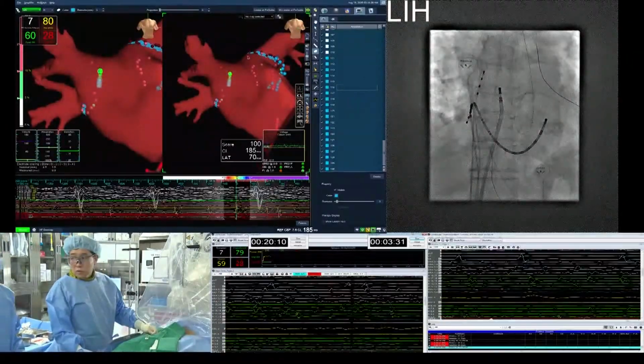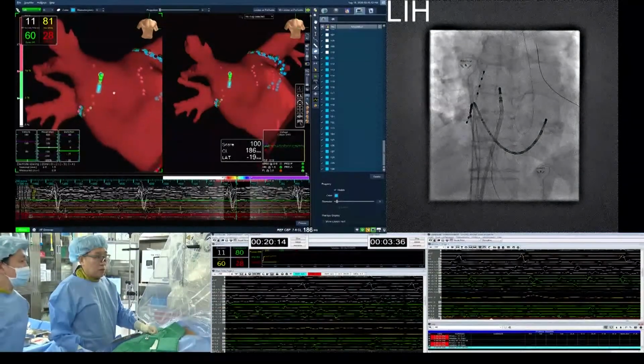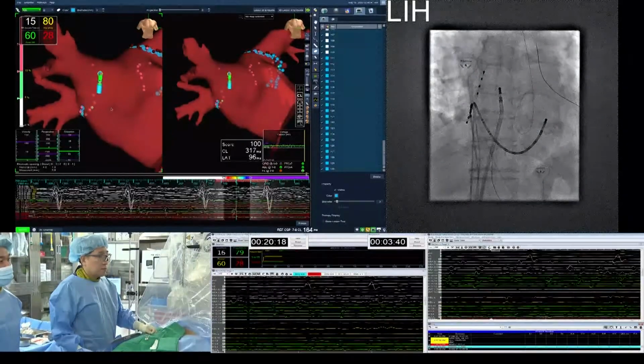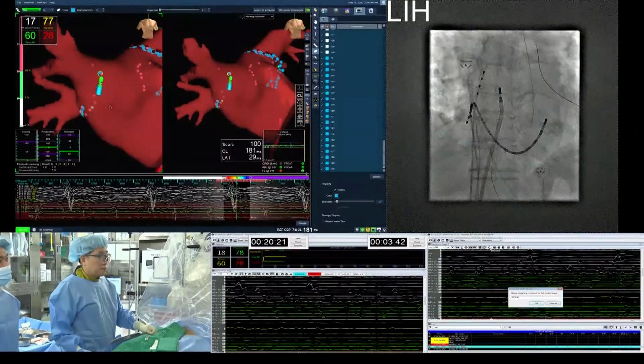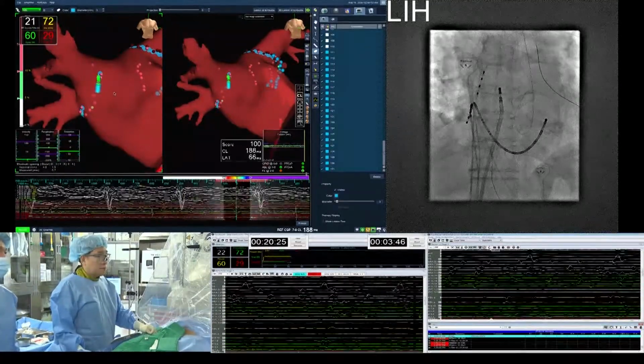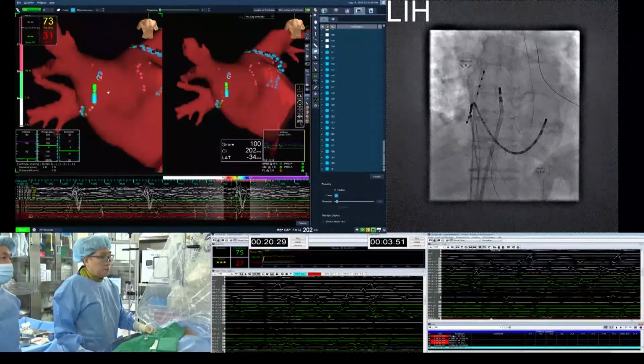This part is an easy and safe area, the septal aspect of the right side pulmonary vein. But if you make the transseptal puncture posterior or high, sometimes it is difficult to ablate this area, because the transseptal hole is here and it's hard to make a good contact.